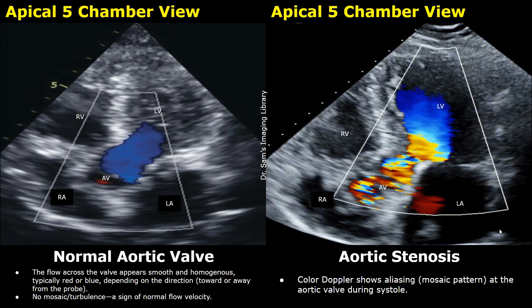These apical 5-chamber views show blood flow across a normal aortic valve and across a stenotic aortic valve with color Doppler applied. Normally, a single color — only blue here — is seen across the aortic valve, indicating normal smooth blood flow. In significant valve stenosis, color mixing is seen at the valve during systole, indicating disturbed flow. We know it is a stenotic valve and not a regurgitant one because the color mixing occurs during systole.